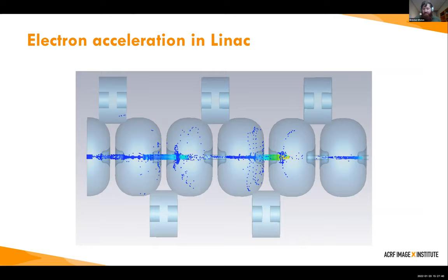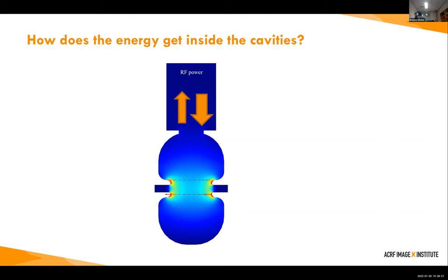Something I haven't explained is how the RF — radio frequency — energy actually gets inside the cavity. It's actually not too complicated: you put a hole in it and pump energy through. There's quite a lot of physics about impedance matching to optimally capture this energy and prevent it bouncing back, but the basics are simple. You can actually see the hole on the physical linac here where the energy goes in, and then through all the coupling cavities it slowly travels through and fills up the linac. That's the waveguide on the other side.